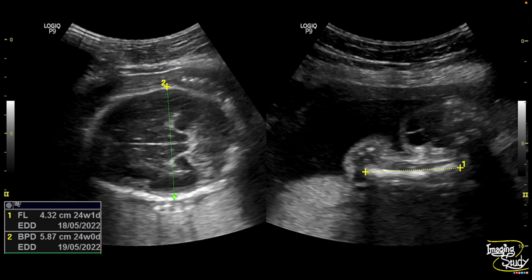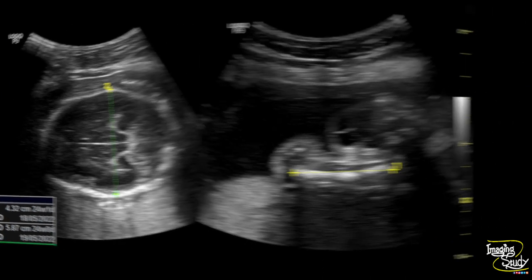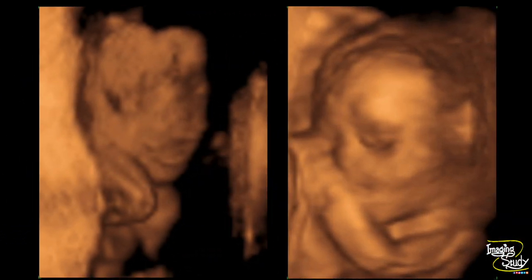The fetus had 24 plus weeks of gestational age. The facial region looks quite normal on three-dimensional ultrasound.